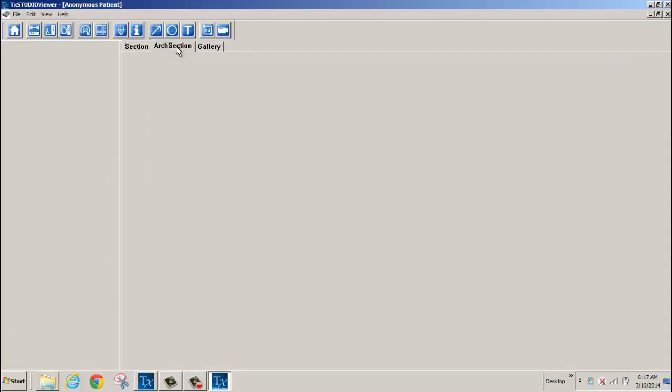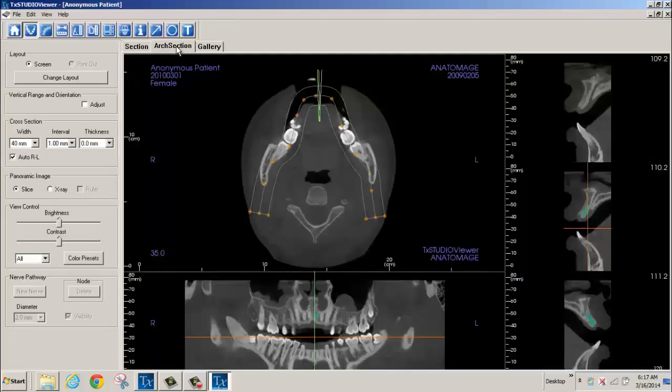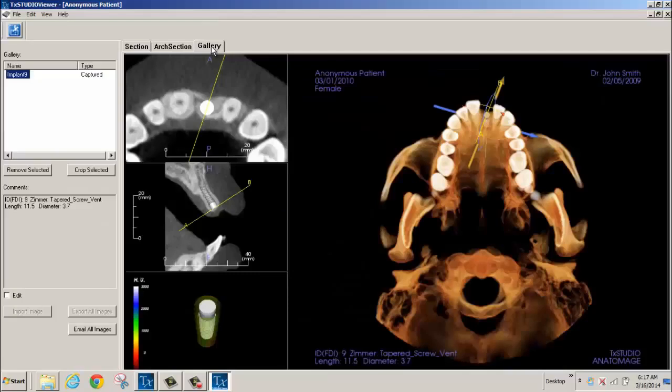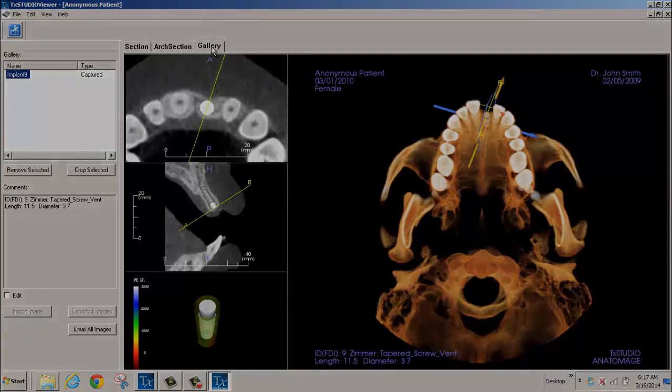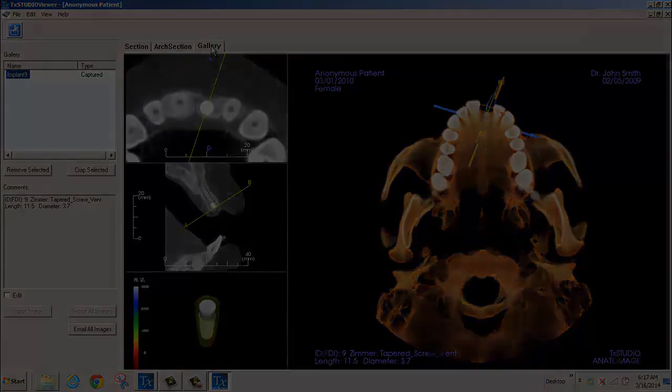You also have the ArchSection tab and you have the Gallery tab that will hold any images that you save for viewing. Thank you for being part of our tutorial today.